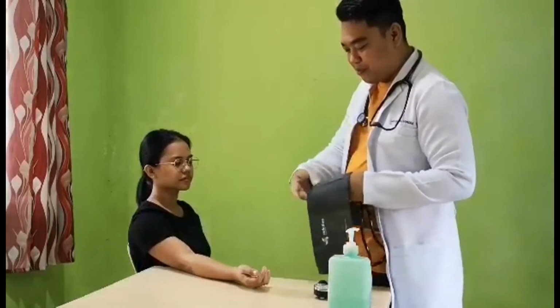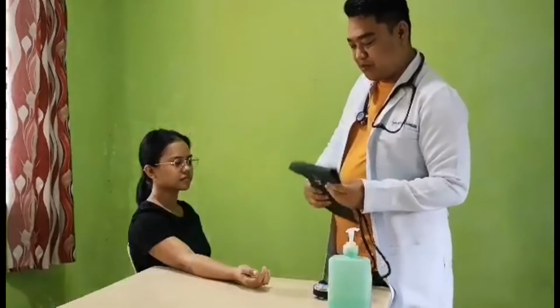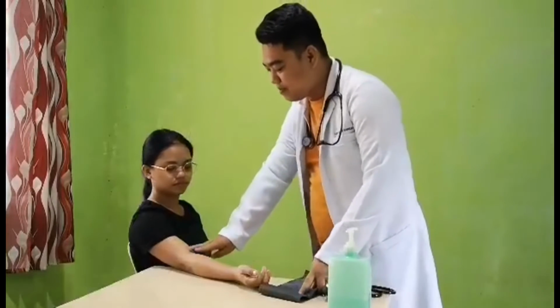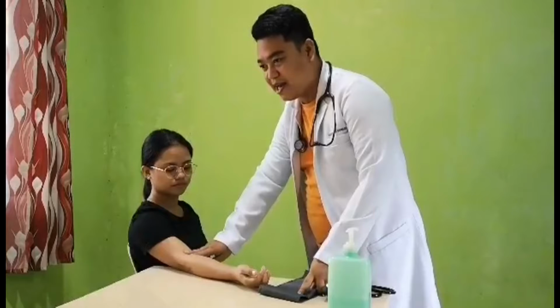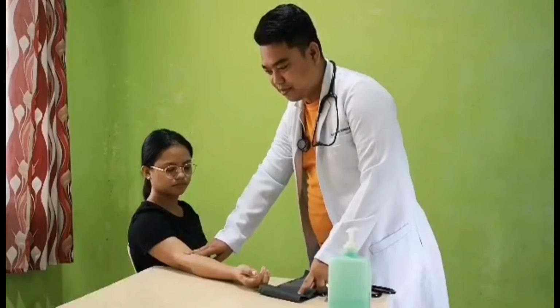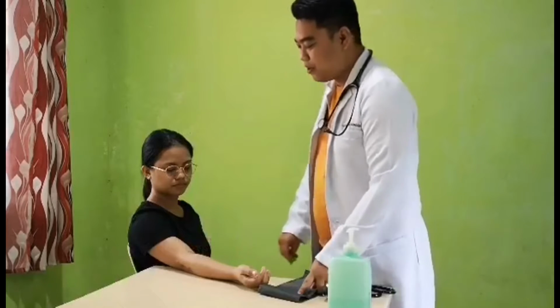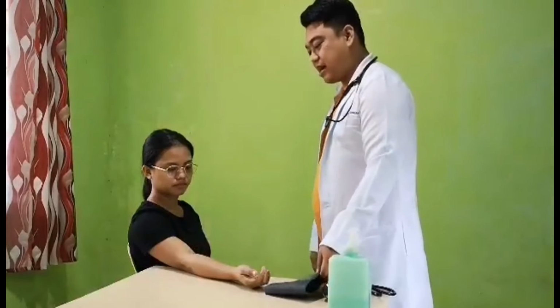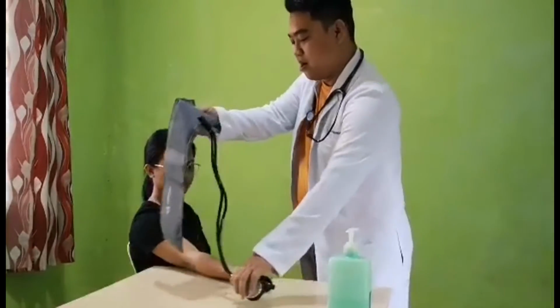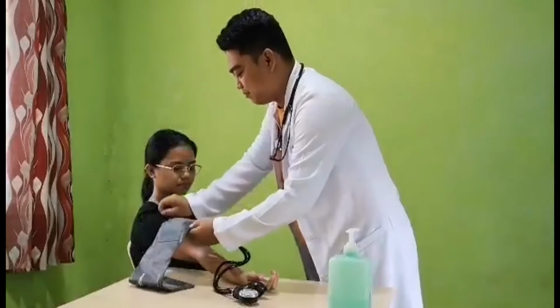Before placing the sphygmomanometer on my patient's arm, I am going to locate the antecubital space of my patient. This is also the area where I can palpate the brachial pulse. Okay, after locating the brachial artery of a patient or the antecubital space, I am going to place the cuff on the arm of my patient.